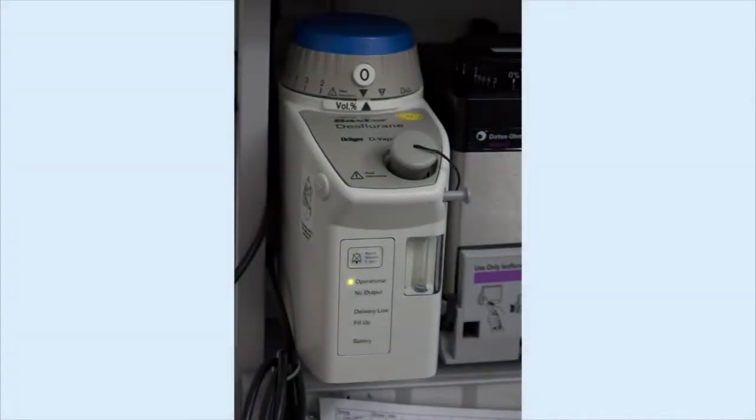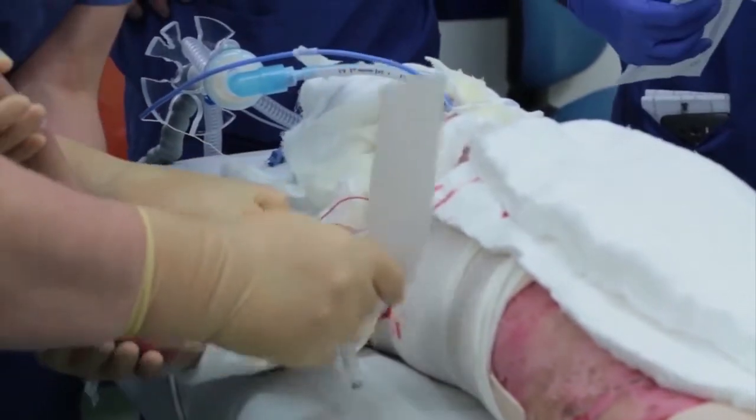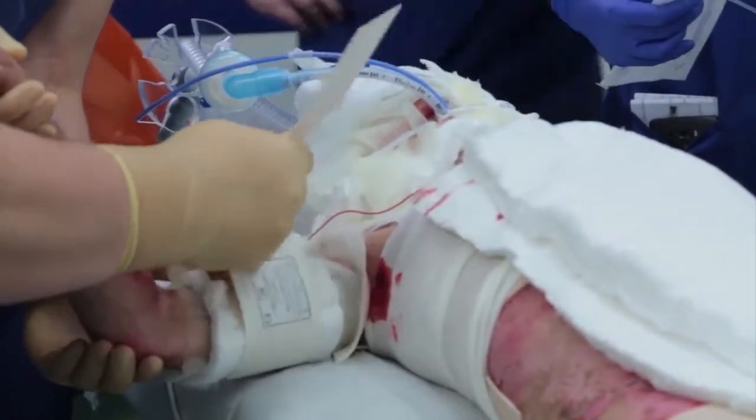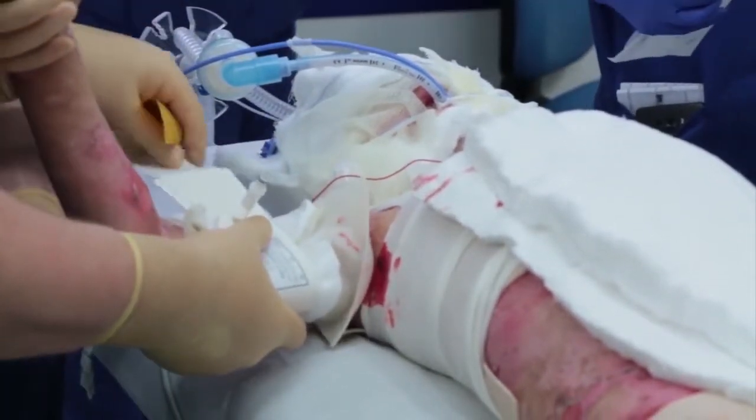Here we will use desflurane for the maintenance of anaesthesia together with remifentanil for rapid wake-up at the end of surgery. TIVA using propofol and remifentanil is equally as effective. Padded, Gelinet-lined tourniquets can safely be applied and are effective at reducing blood loss and improve the visualization of the surgical site for the surgical team.